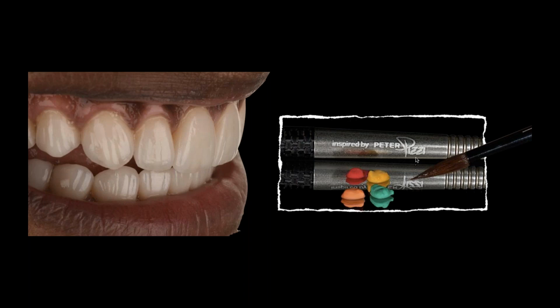All right, and then Daniel has a question. A bright shade, a bleach shade, Ivoclar BL1, but in the VITA system, probably a 0M1/2. The patient wants that brightness, wants that bleach shade, but also wants depth and translucency. Is there a way to handle that?